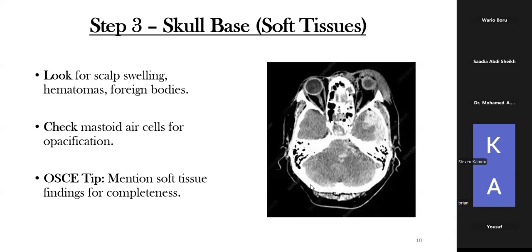Do they bring one CT scan image or a series? Most commonly, Billy, the one that I have come across is you have one scan. Remember, you have 10 minutes, so the examiners have to be very fair to you. You're given one scan to describe. At postgraduate level, you can even be given 10 scans to go through in 10 minutes, because our expectation is a bit higher.